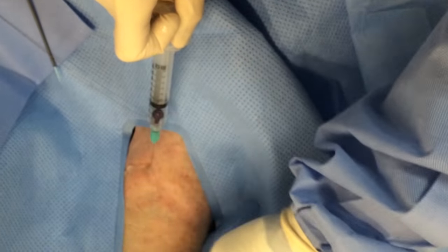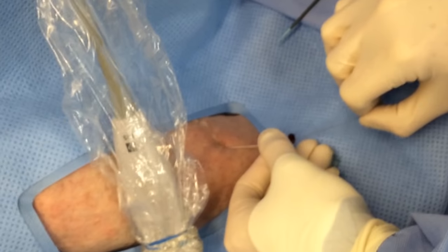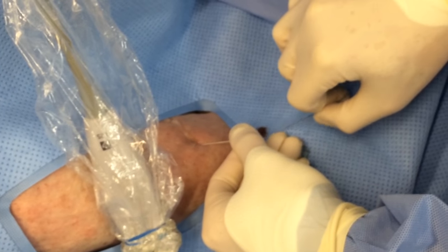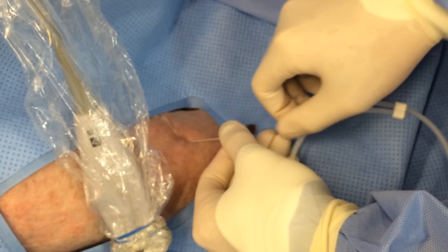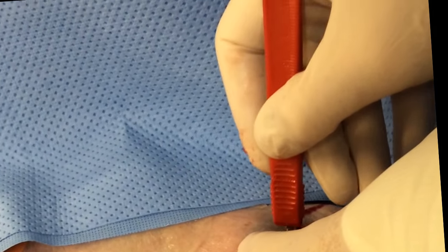He's now poking with the non-safety needle. He gets his flash, disconnects the syringe, takes the beautiful floppy wire, advancing it into the vein. You can see it goes super easy, telling you you have a nice patent vein — we feel good about this. You don't have to put it all in; you really just need enough so that you're about halfway down the wire.